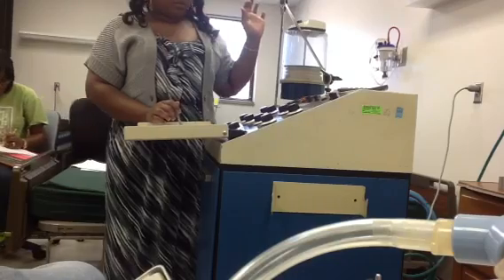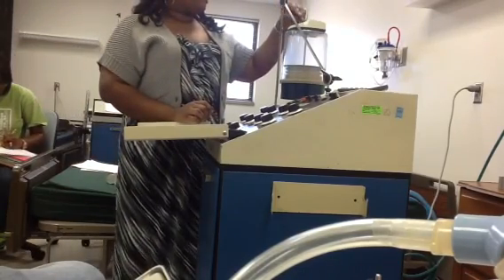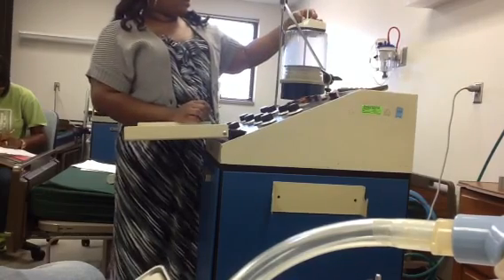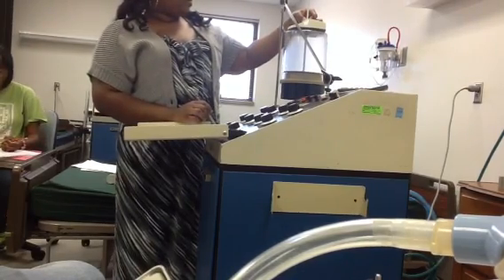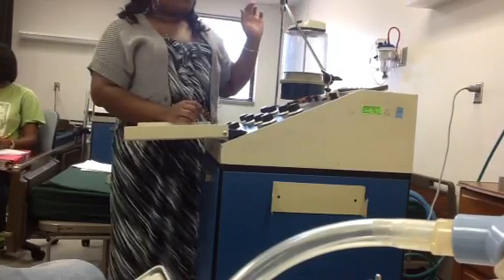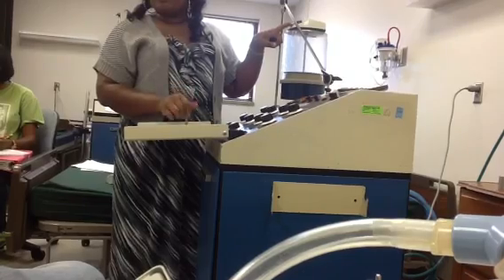Don't want to check your settings. I might have messed them up a little bit. Okay. That's cool. No, you didn't mess up. But what is that knob on the spirometer? This one? Yeah. That's the one you set 1 to 2 above your total cycle time. Okay. It's your time delay button.